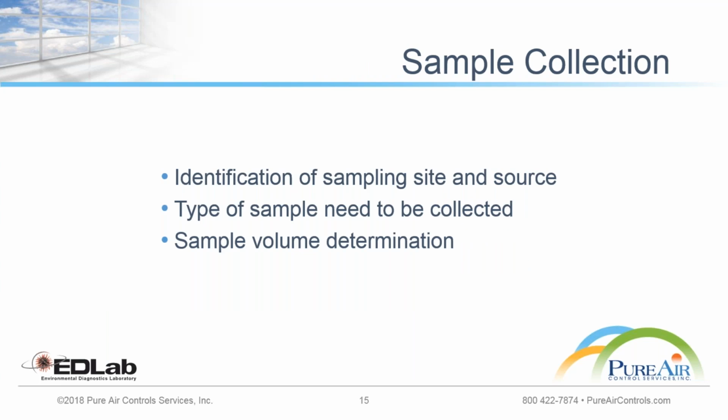Could you tell us about some of the things that should be initially determined when it comes to collecting Legionella samples? Yeah, of course. Very first thing, you have to determine where you are going to collect the sample and try to mark those spots where you are going to collect the sample, such as point of use or the water reservoir. And then second thing, you have to determine how much sample you're supposed to be collecting, which I will be talking about a little later in the presentation.